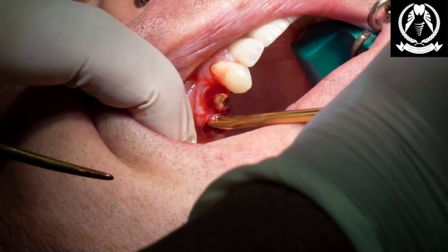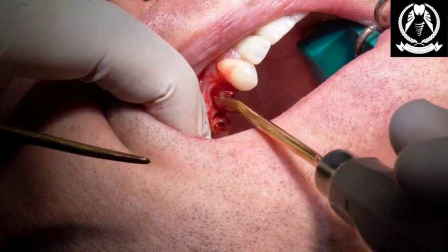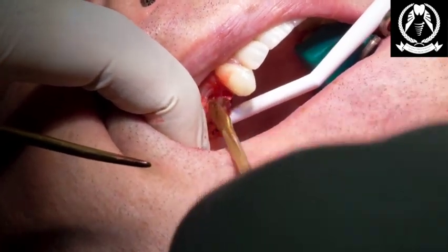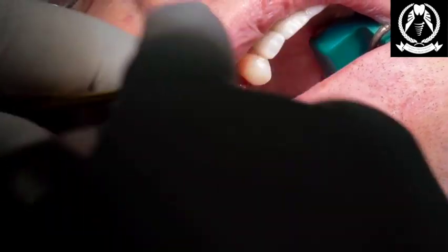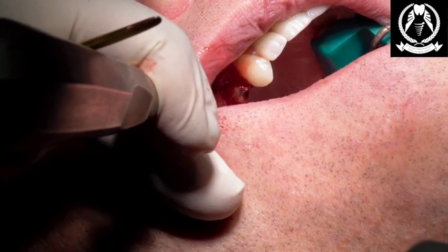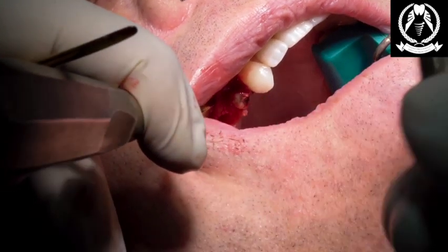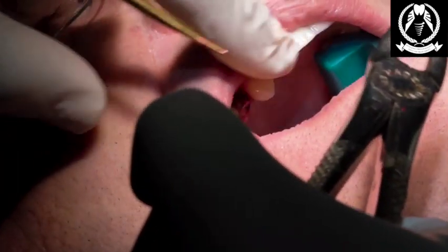Okay, that's fine. I'm going to rotate that fella. Real rotation. Nearly there, Alan. Yeah, it's all good. Right, and I'm just going to reflect that papilla. Take enough time about that. There we are. Beautiful. Okay. So that's partially moving, root forceps. Awesome, thank you very much. Just a little wiggle. Out it comes by the other teeth. So that's the first root removed, Alan.